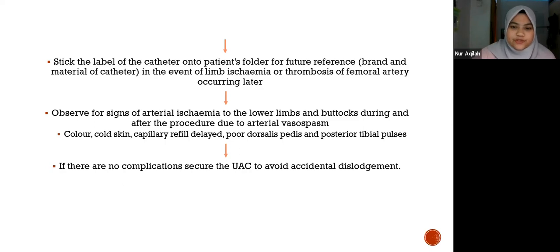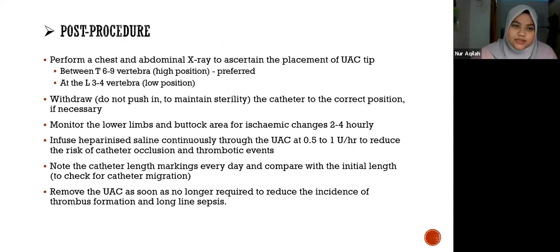We assess for the capillary refill time, whether it is delayed more than 2 seconds. And we also assess the dorsalis pedis and also posterior tibial pulses. If there are no complications, then we can secure the UAC to avoid accidental dislodgement. So here is for the post procedure, what we have to do.